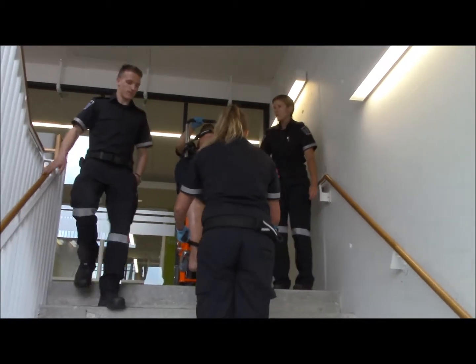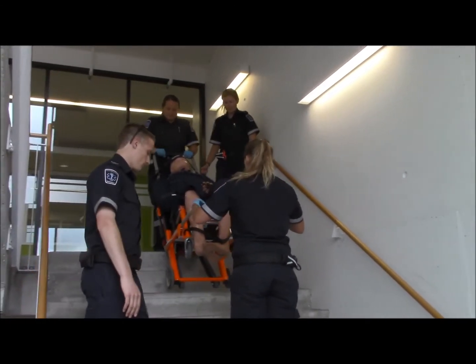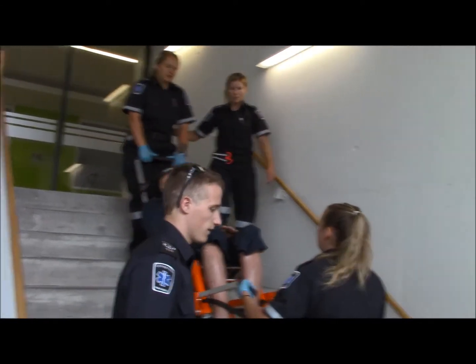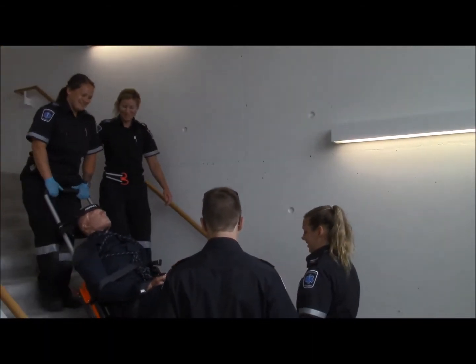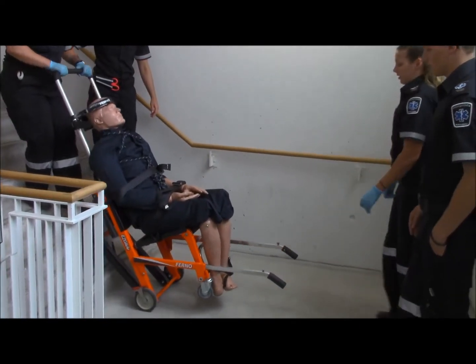We already spoke about the foot end being adjustable. Well, the descent requires you to use this handle that comes out of the top, and both students have adjusted their settings appropriately for their lift down. It's not as much a lift as it is a guide because the track is doing most of the work. Nonetheless, it's an essential component of this circuit, and so you'll be required to know how to do that.